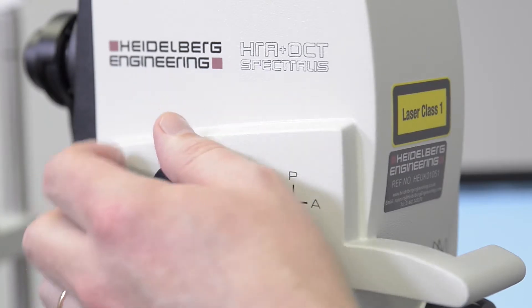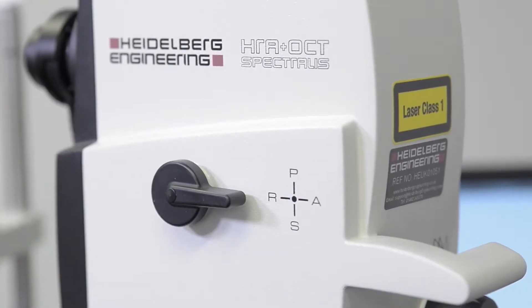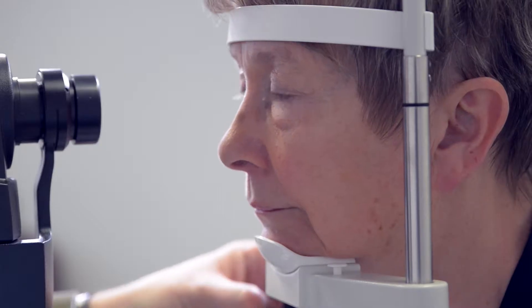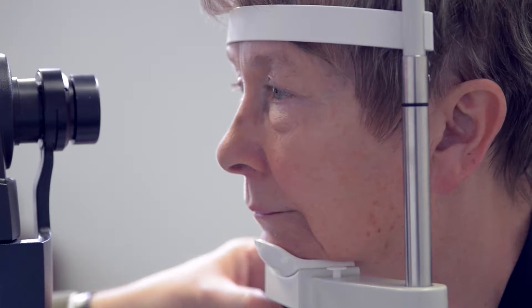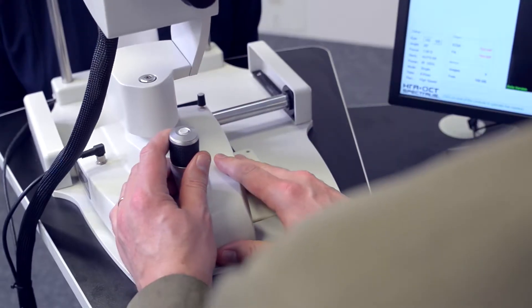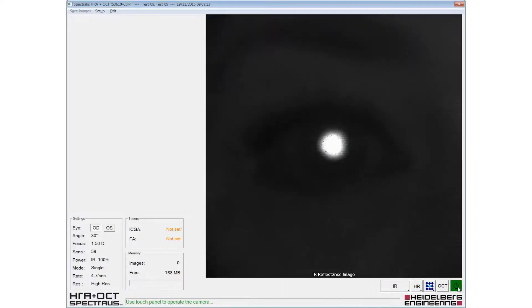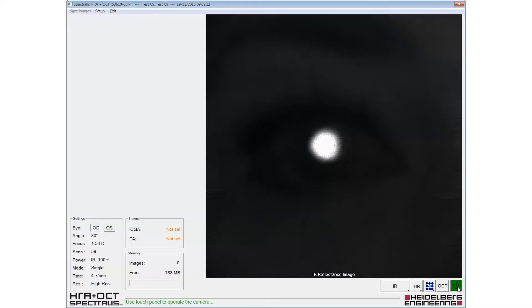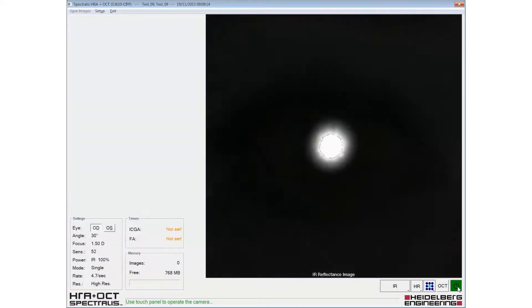The appropriate fundus imaging modality should be selected and the headrest should be adjusted so the outer canthus of the eye lines up with the mark on the headrest. The patient should be instructed to look at the internal fixation target.